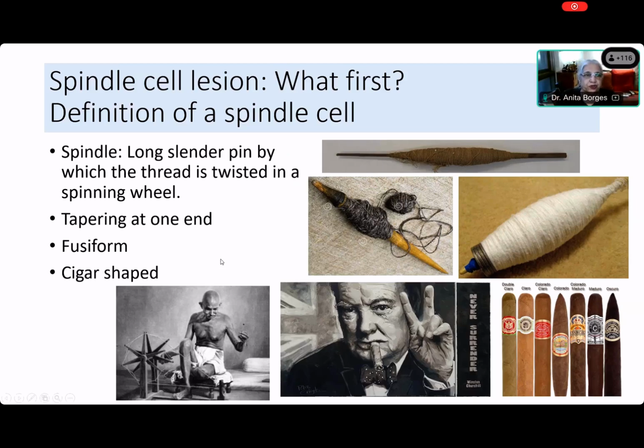But you have different kinds of shapes of the spindles. There is one that is tapering at one end. You can have something that's fusiform, and we use this term fusiform, which means both ends taper. And then you have a cigar shape, which is actually like a cylinder with blunted ends at either side. Some cigars do have a slightly pointed end, but most often cigars have a blunt end and a cylindrical kind of shape. So all of these are essentially spindle cells.